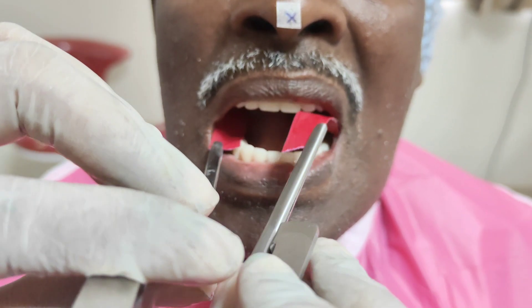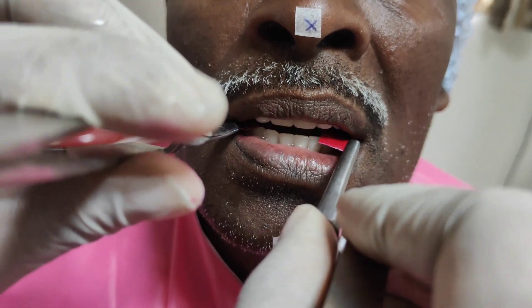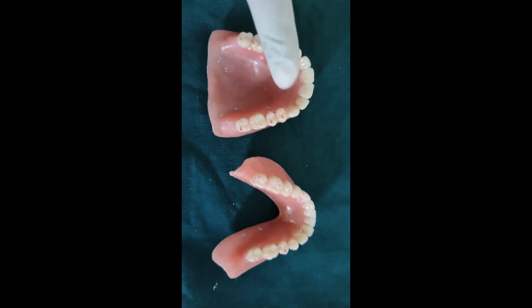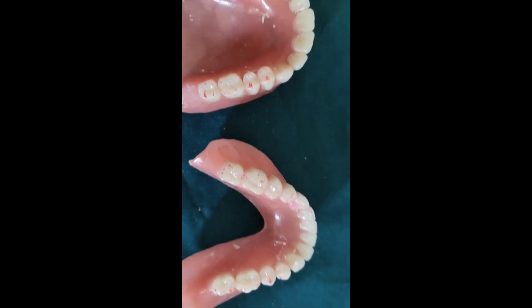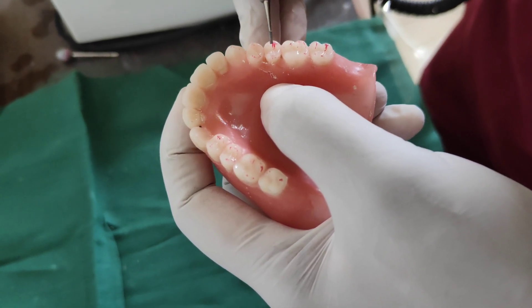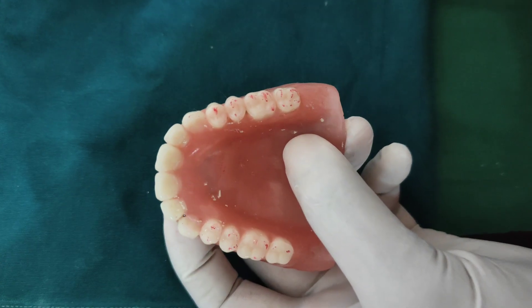Centric contacts are checked with the help of articulating paper. The articulating paper is placed inside the patient's mouth and the patient is asked to bite several times in centric contact. High-pressure contact points marked on the denture surface are examined after removing the denture. These high-pressure contacts are reduced by trimming only the inclines of the cusps — the cusp tips should not be reduced. The denture is then reinserted and rechecked.